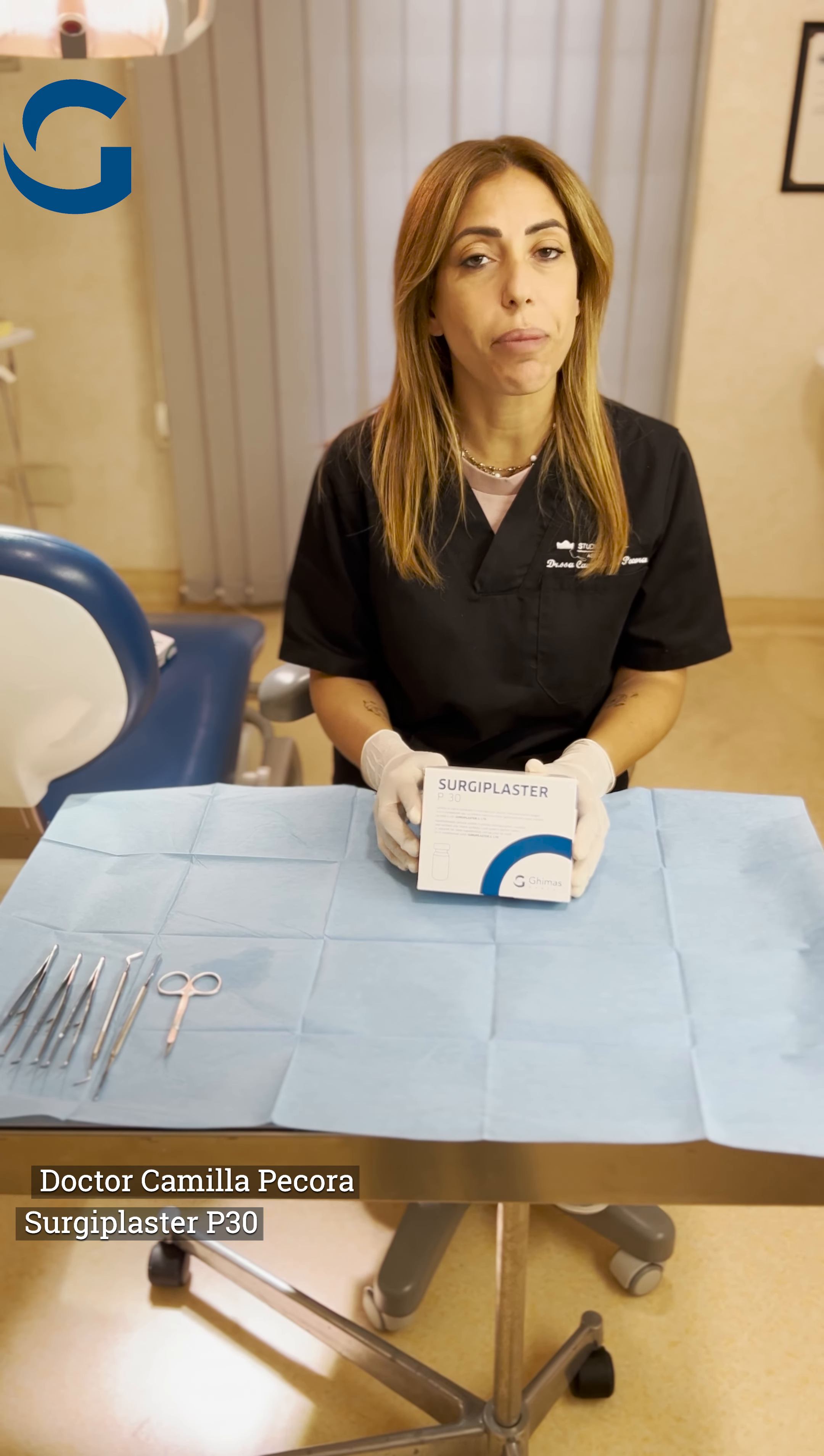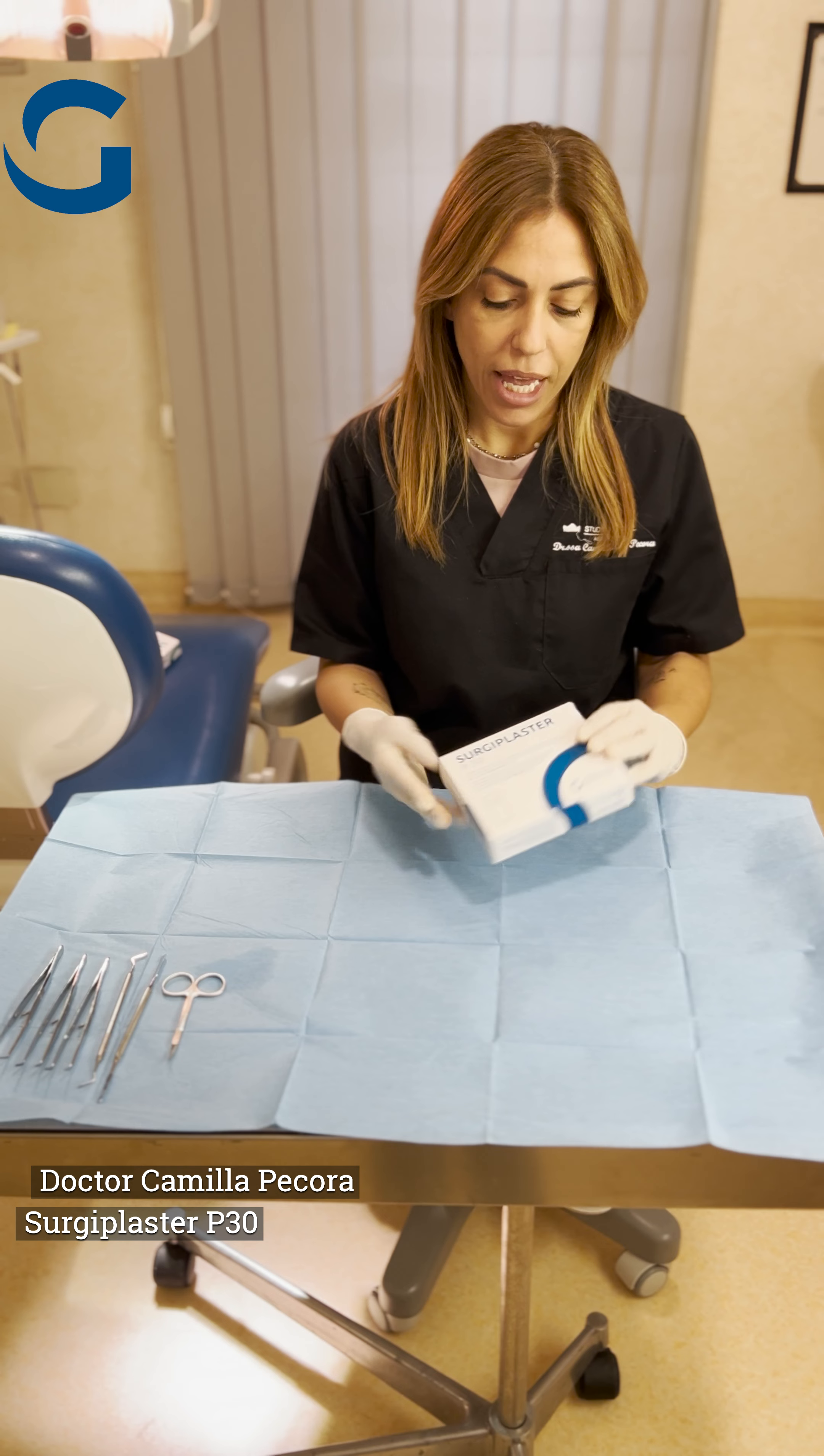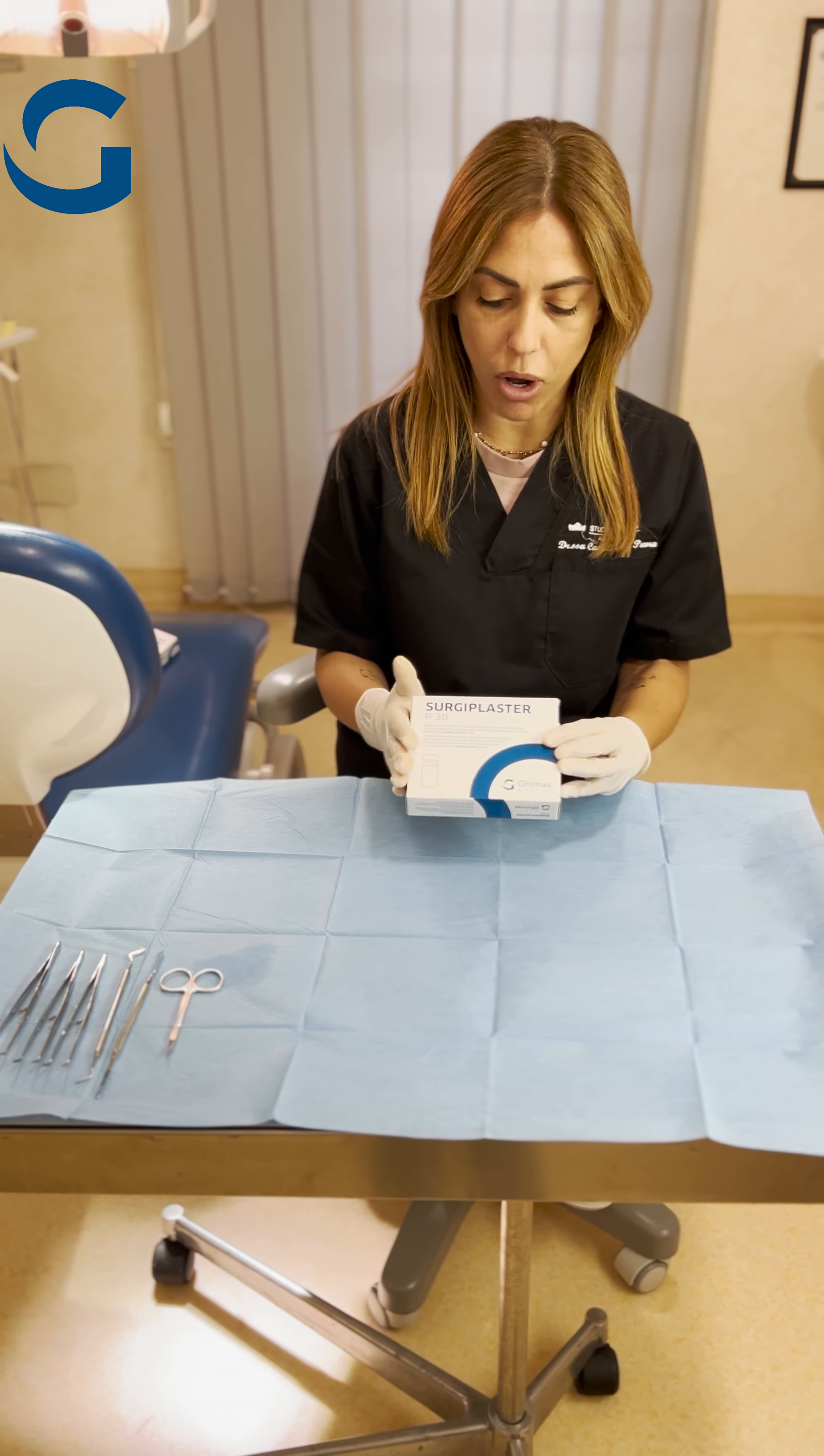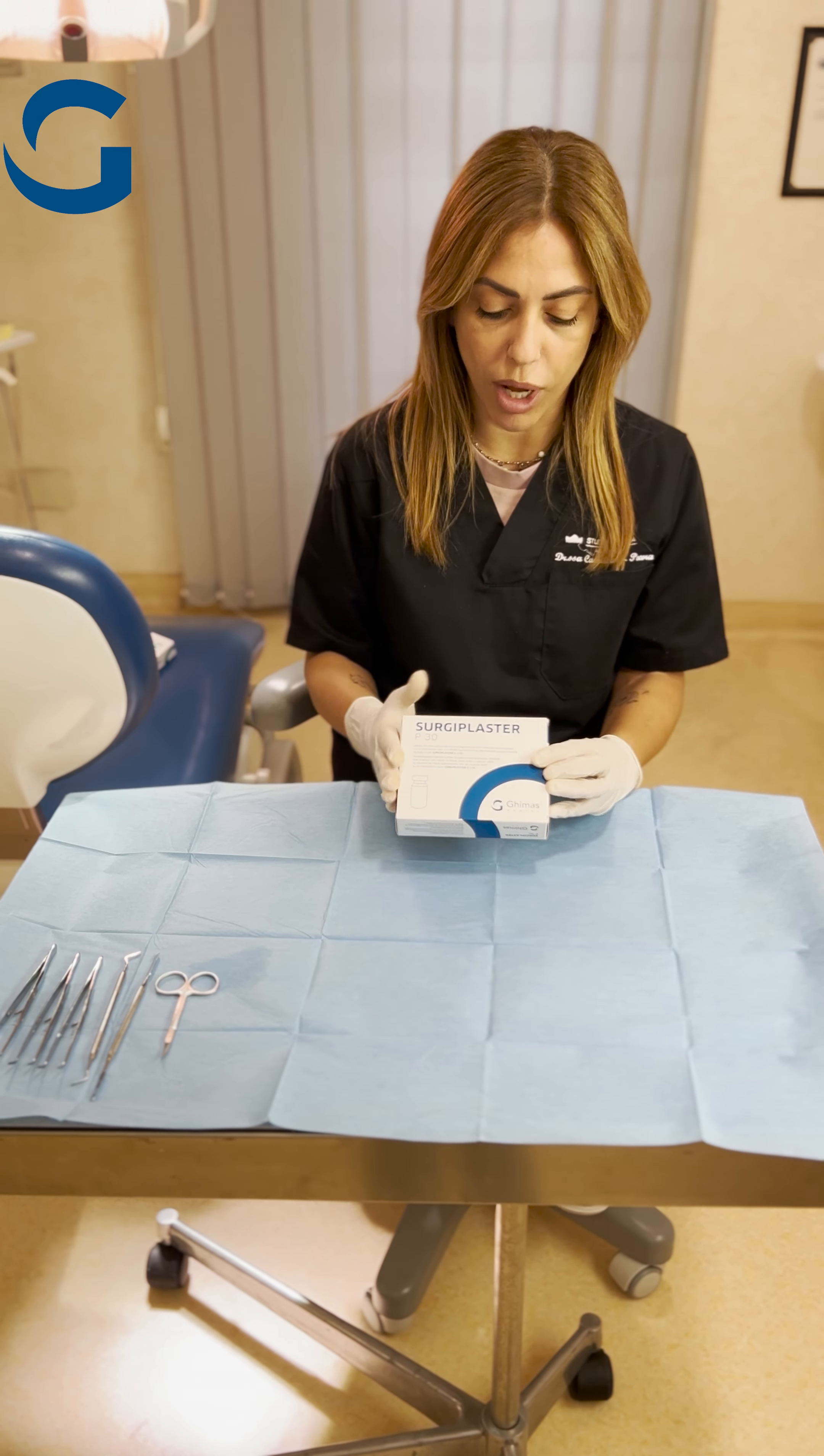Today we're going to talk about the Surgiplaster P30. This is the smallest granulometry and this is the color code that you have on the outside box so you can identify it very nicely. This is the blue one.